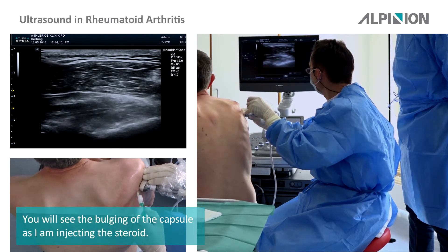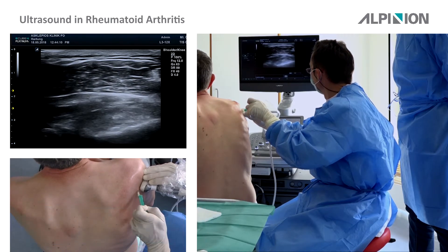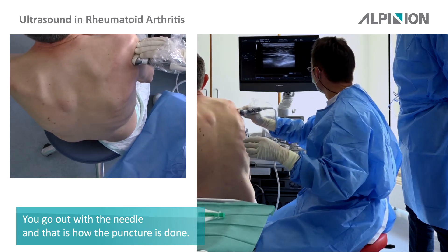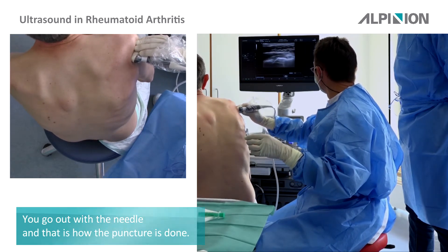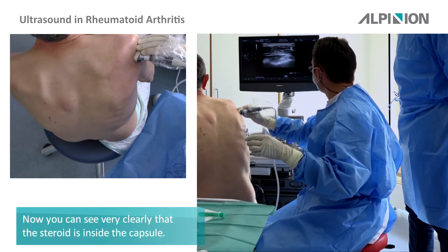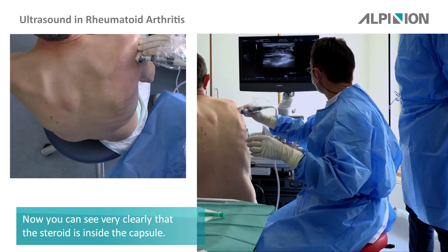You can see the bulging of the capsule as I am injecting the steroid. Now going out with the needle — the puncture is done. You can see very clearly that the steroid is inside the capsule.